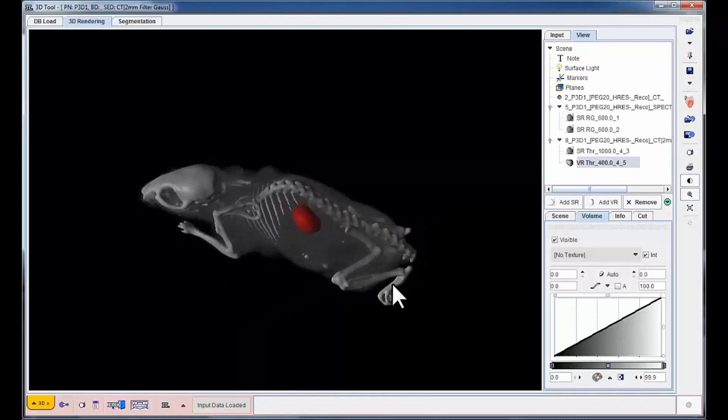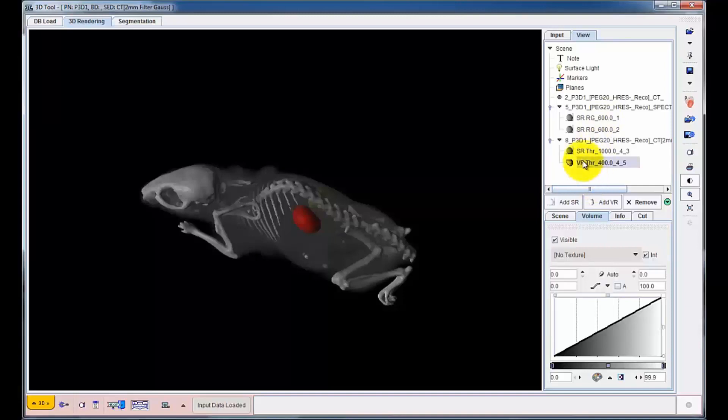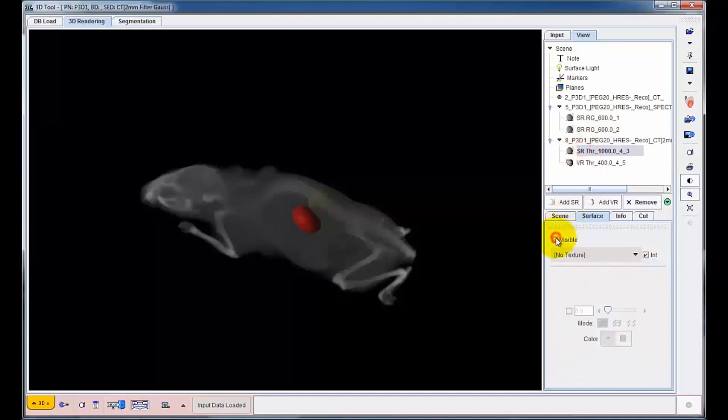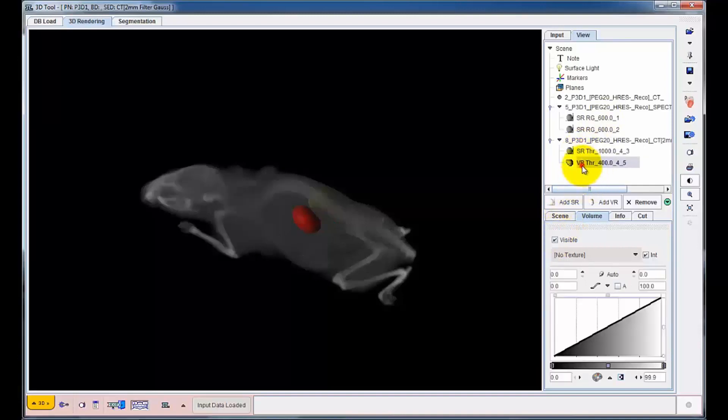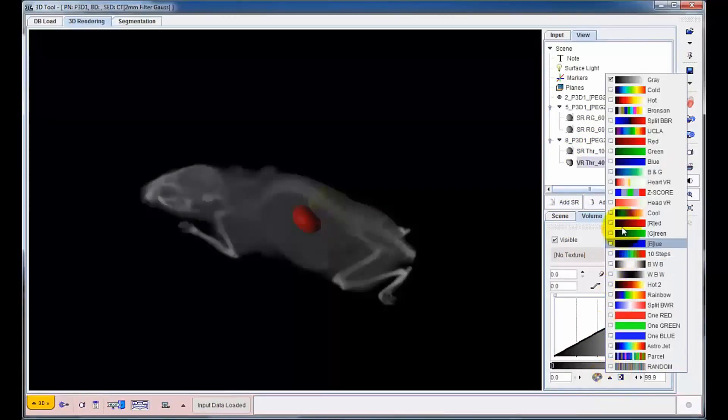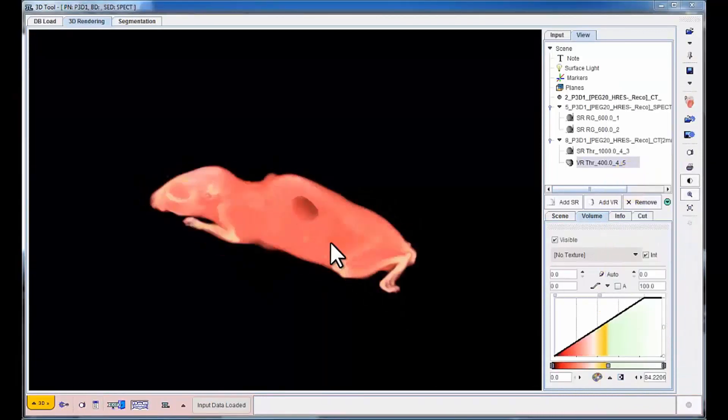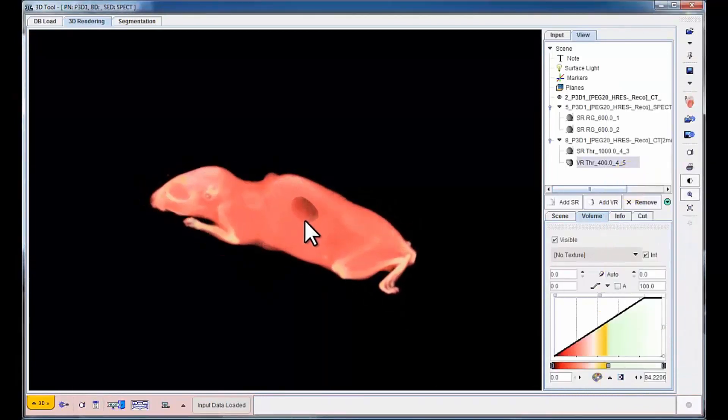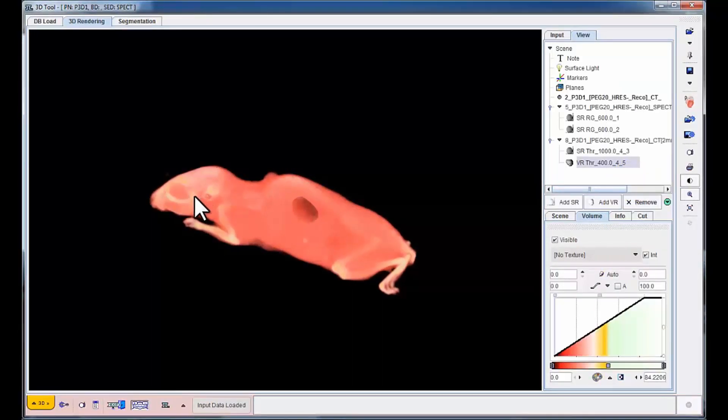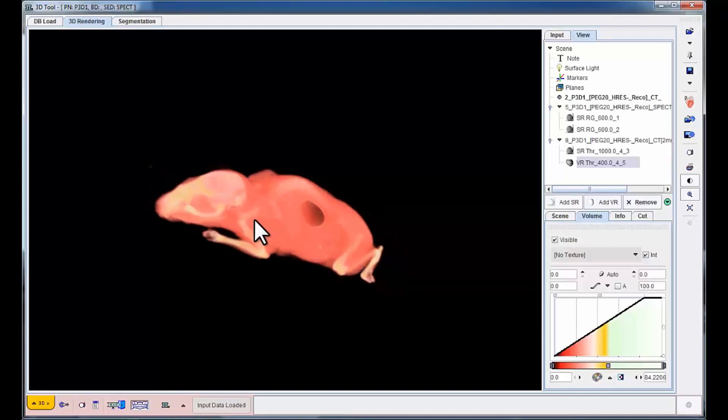By switching off the skeleton rendering and using a specific colour table, a typical volume rendering of a CT scene can be generated while maintaining the visibility of the inner kidney volumes.